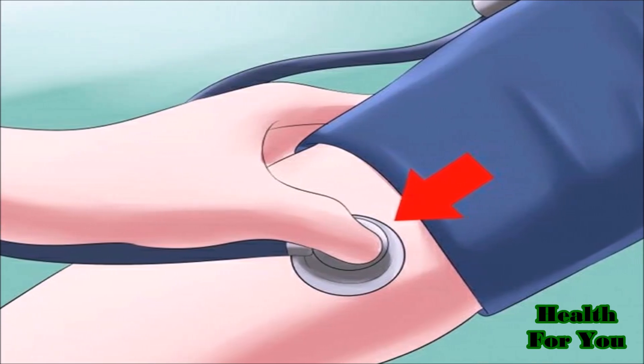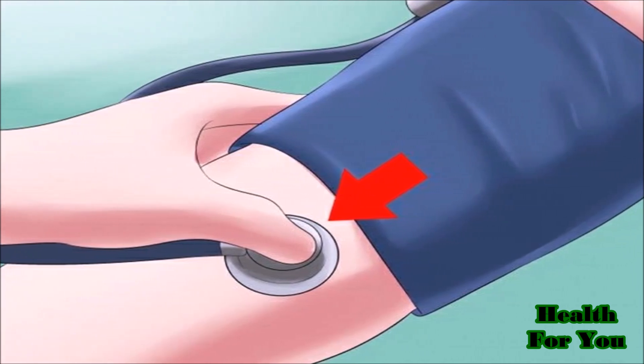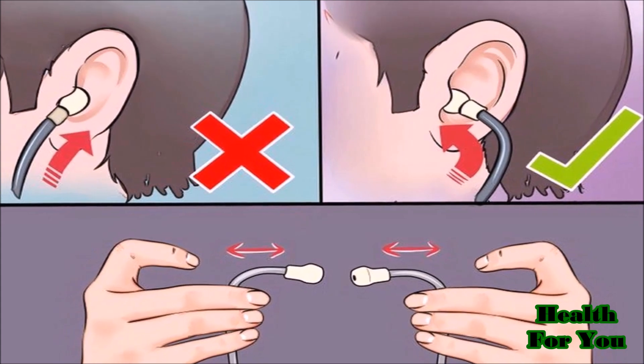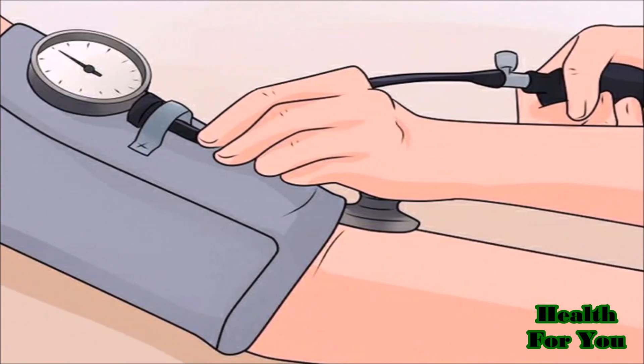Place the stethoscope head under the cuff where you felt the pulse. Put the stethoscope earpieces in your ears — they should face forward and point toward the tip of your nose. The gauge needs to be positioned where you can see it.